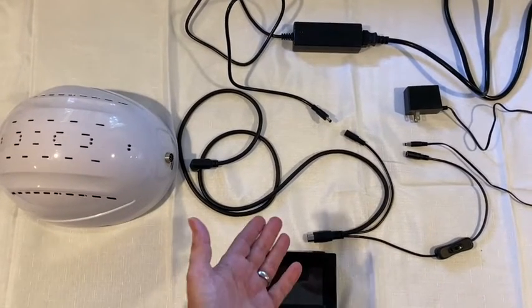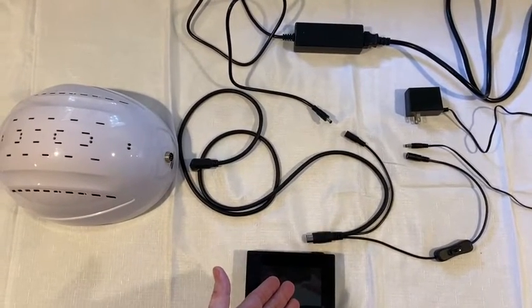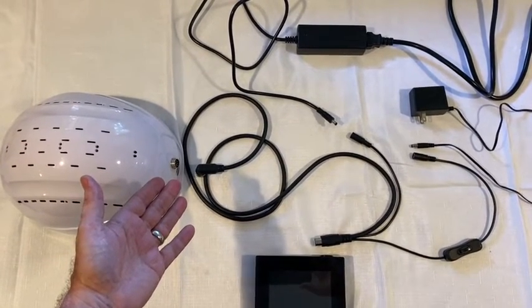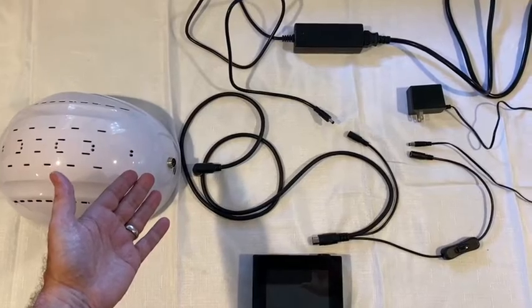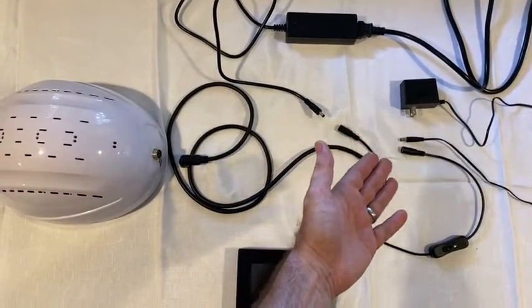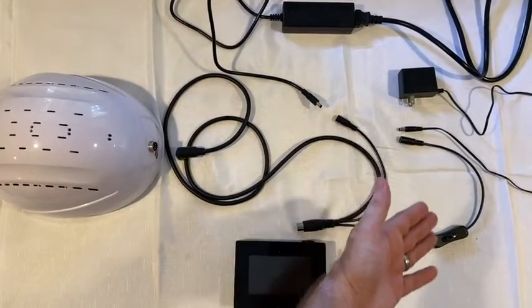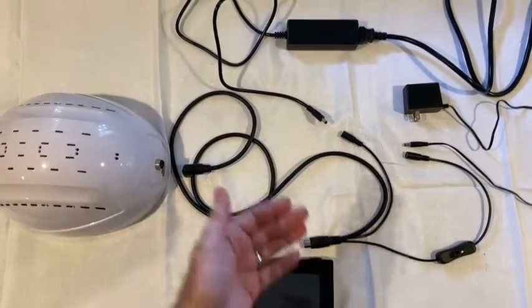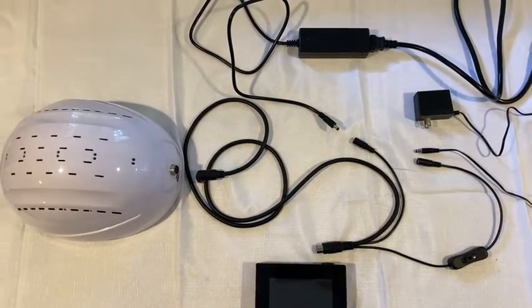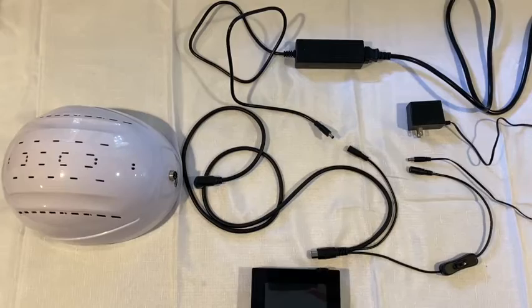The DIN connector will plug into the controller. The other end of the DIN with the 90-degree turn will plug into the helmet. The small adapter will plug into the cord with the switch in it, and the large power supply will plug into the other extension. So we'll see what that looks like here in a moment.